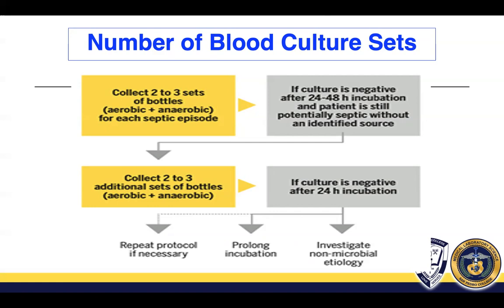Now, if the culture comes out negative after 24 to 48 hours of incubation and the patient is still potentially septic without an identified source, collect another 2 to 3 sets, then incubate.